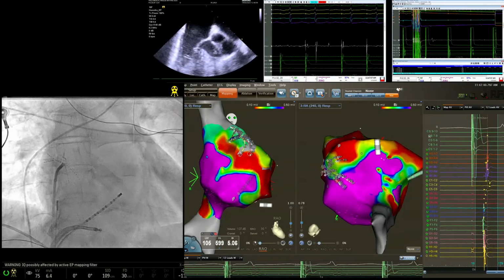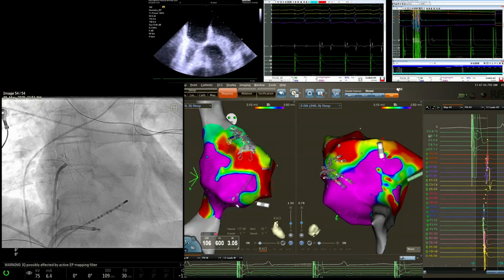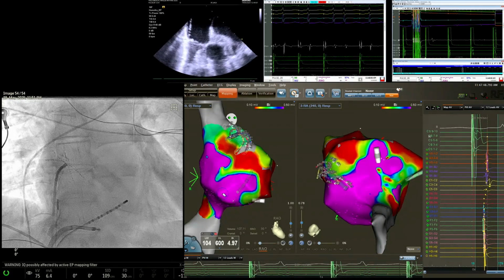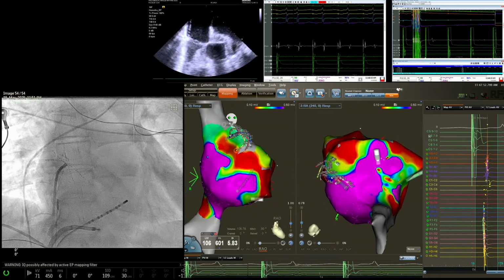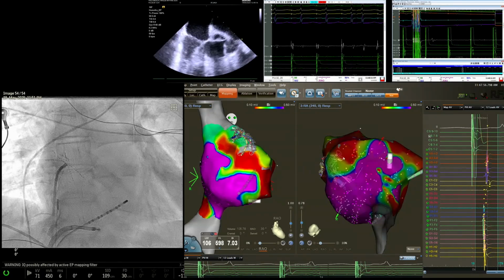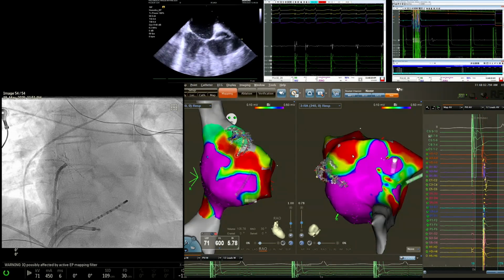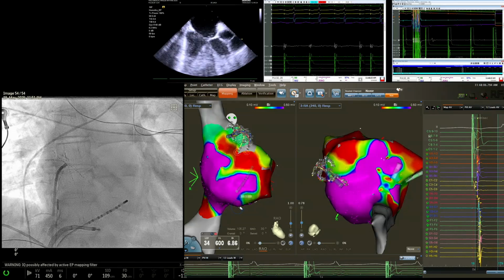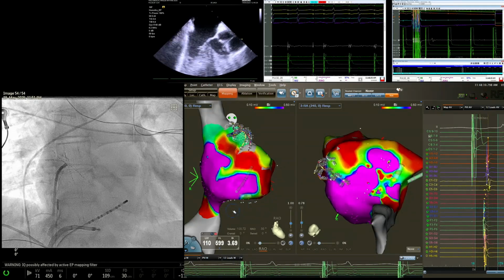Okay, so now, as I said before, with every PF energy source, I'm absolutely convinced that you get spasm. I have yet to play with one that doesn't cause spasm. We've not tested really carefully the best protocol for this, but we're going to use the protocol that we typically use for most of these technologies. Is this phenylephrine? Yeah. How much is it? 500 total? Yes, total. All right, I'll give most of it.